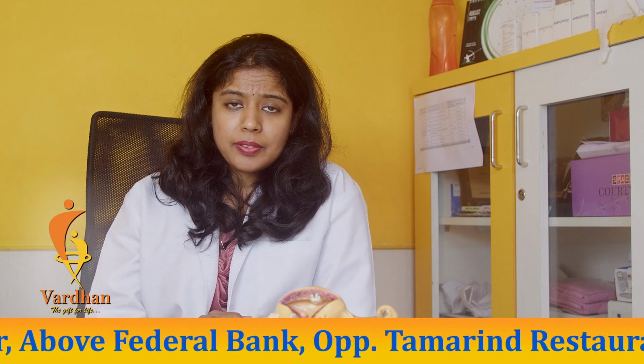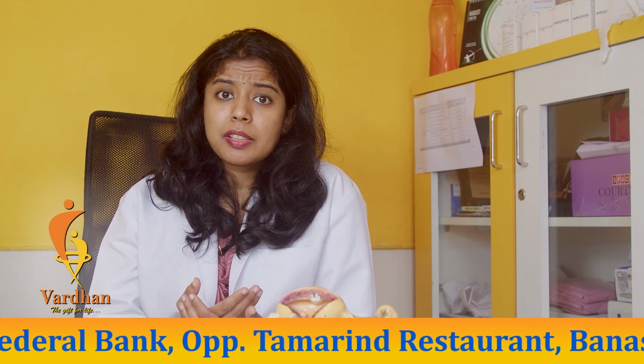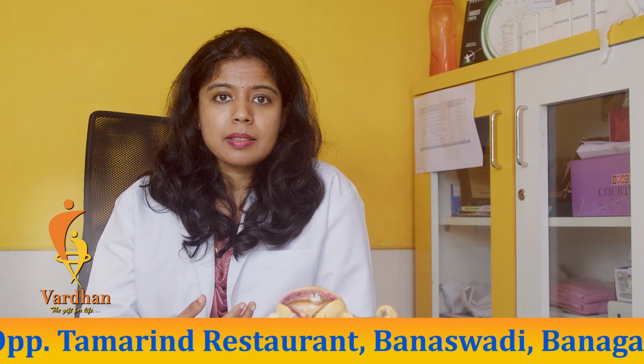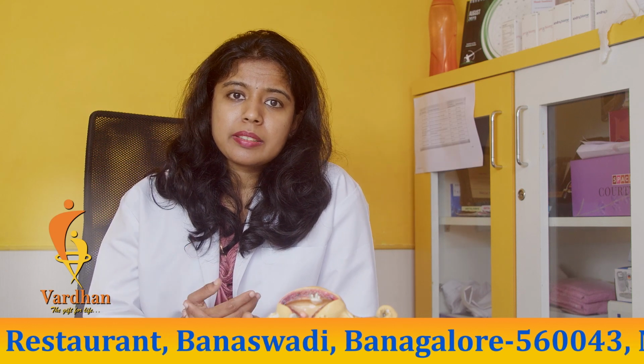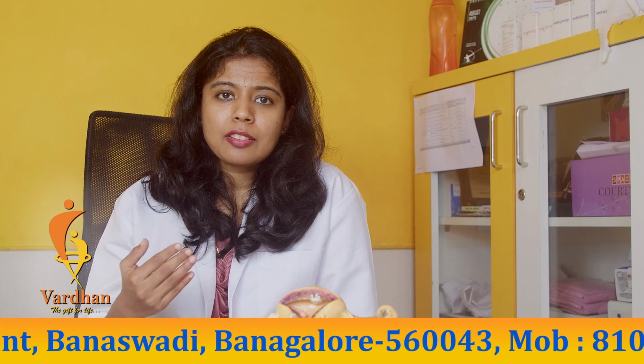There are a few conditions where we do not do HSG. For example, if we suspect that there is some infection in the tubes, which we would get to know by patient symptoms. If she says she has a lot of white discharge, or if she has pain in her tummy, in these situations we do not do HSG because it causes further spread of infection. So that has to be ruled out.